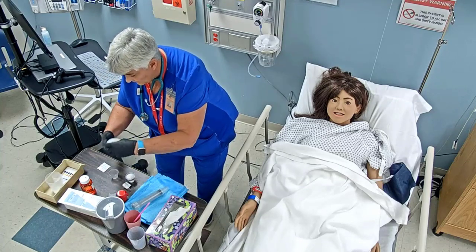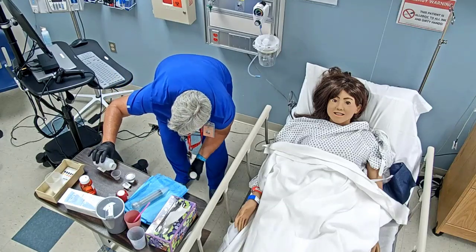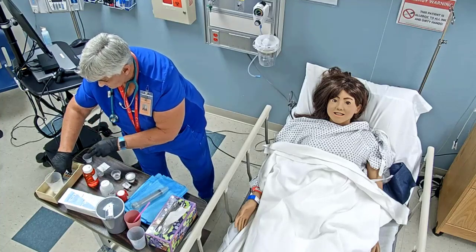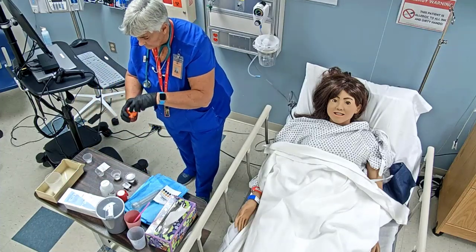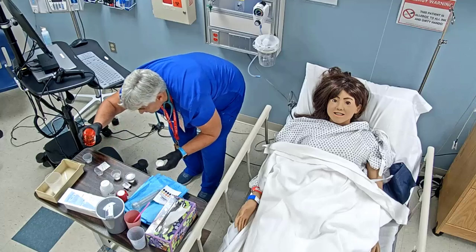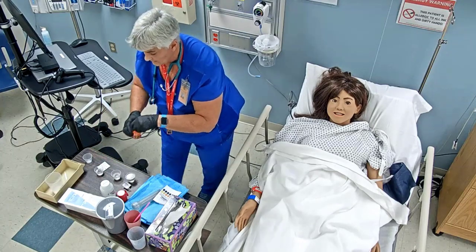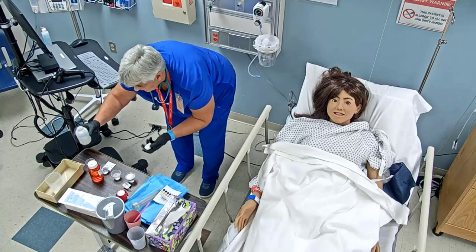And then I'm going to get my 15 because we're going to flush in between. So finding my 15, there it is. Okay, and then I've got my Pepcid, which is the 15 as well. When you see a 15, you always want to get down eye level where the meniscus is, okay? And so that's with that medication, and then I need one more 15 for the end.